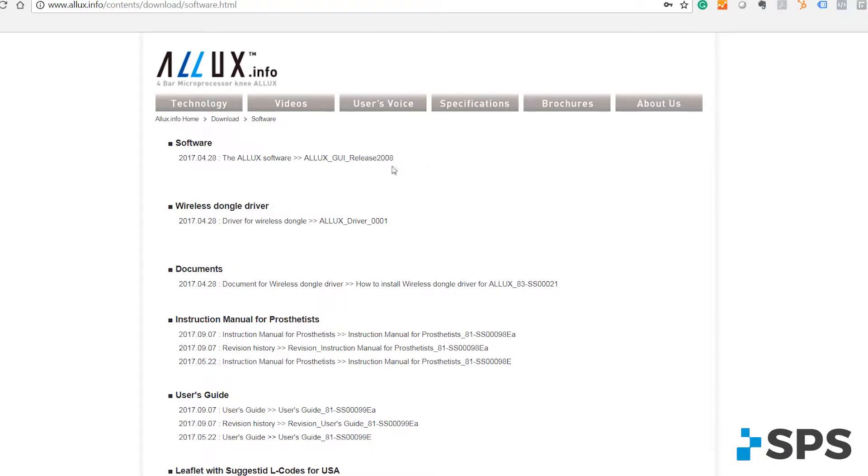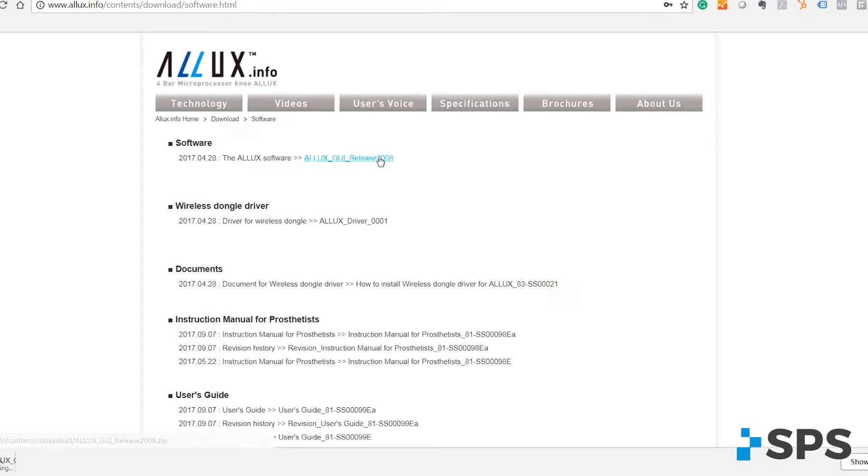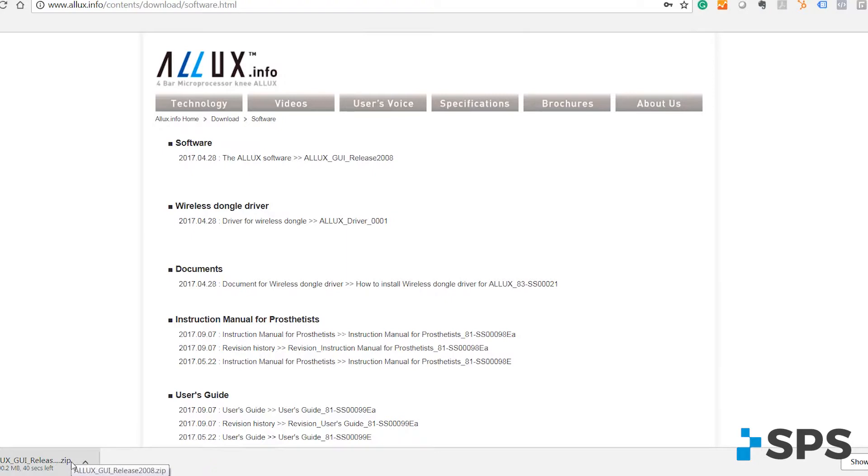By the way, you need to make sure you know if you have a 32-bit or 64-bit system to load the correct wireless dongle driver. We will show you how to do that in just a second.